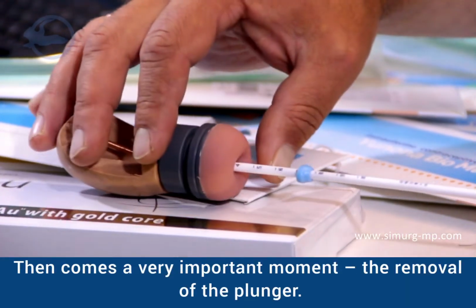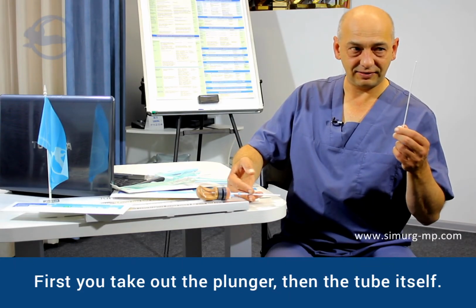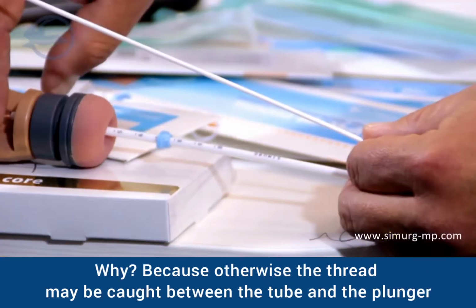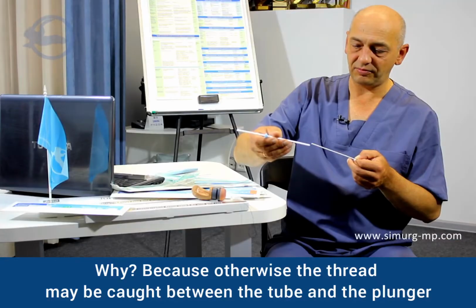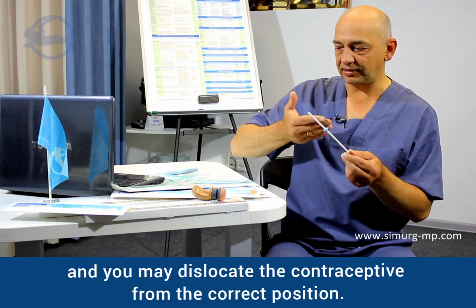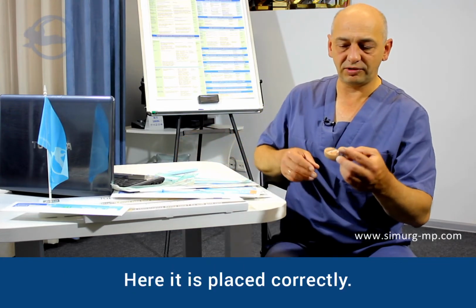Then comes a very important moment, the removal of the plunger. First you take out the plunger, then the tube itself. Why? Because otherwise the thread may be caught between the tube and the plunger, and you may dislocate the contraceptive from the correct position. Here it is placed correctly.